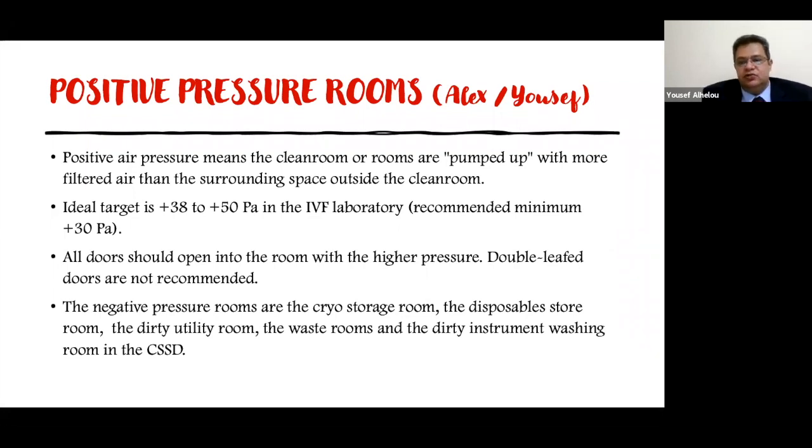The purpose of the positive pressure is to prevent contamination. On the other hand, we also need some negative pressure rooms to prevent contamination: the rooms where we store dirty and used OT equipment, the garbage rooms, and the plastic storeroom, because it generates a lot of VOCs.